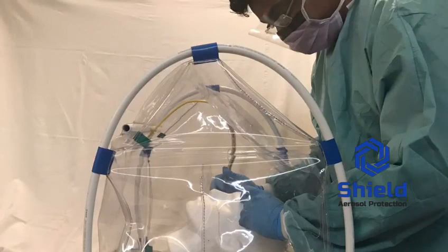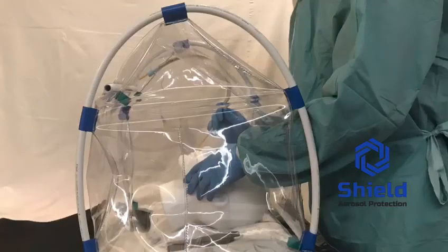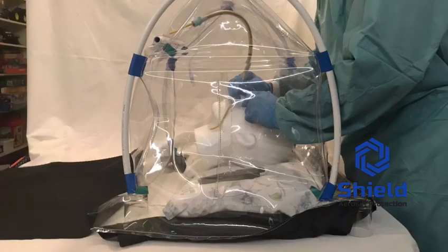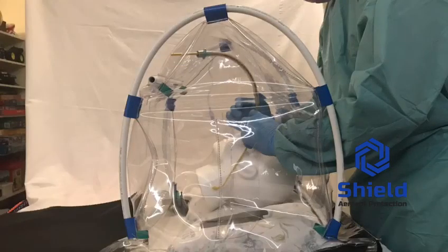It must be remembered that the bougie must be passed into the endotracheal tube inside the tent to minimize the risk of viral contamination moving outside the tent by passing the tube back out or passing the bougie in and then asking an ODP to railroad the tube as would normally be the case.